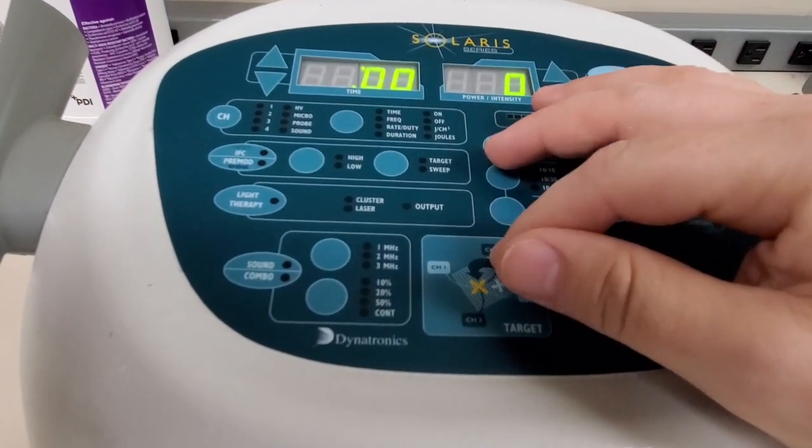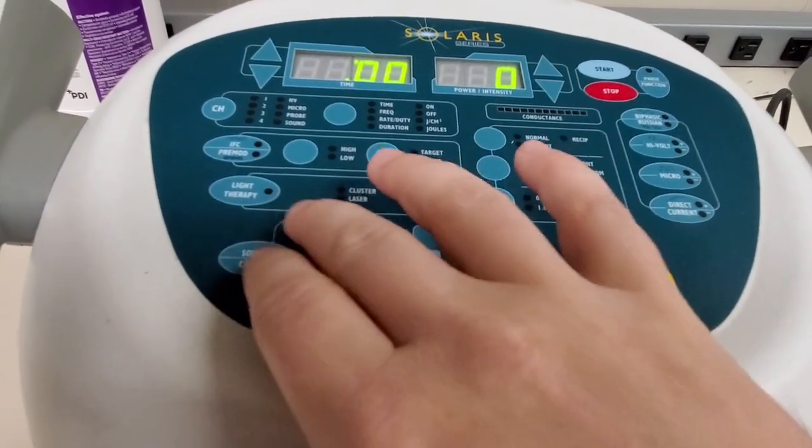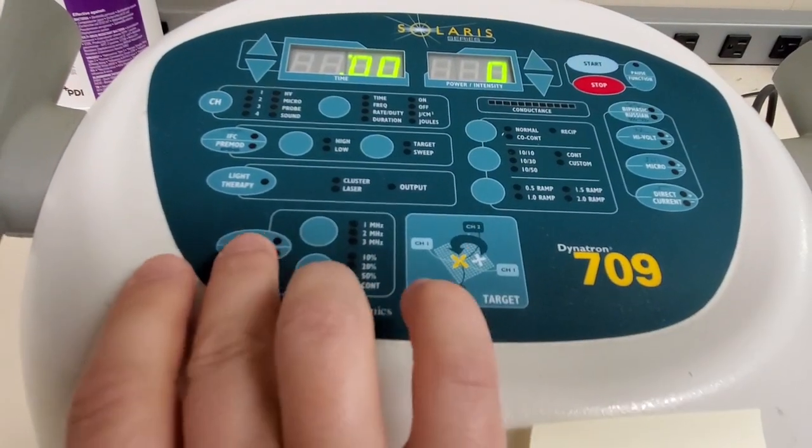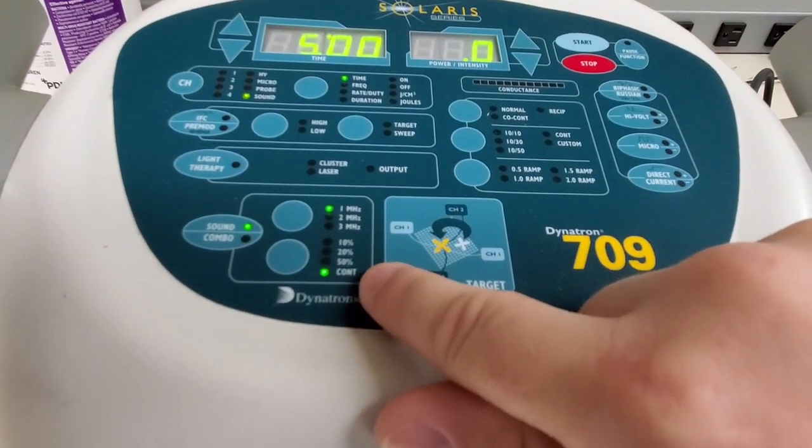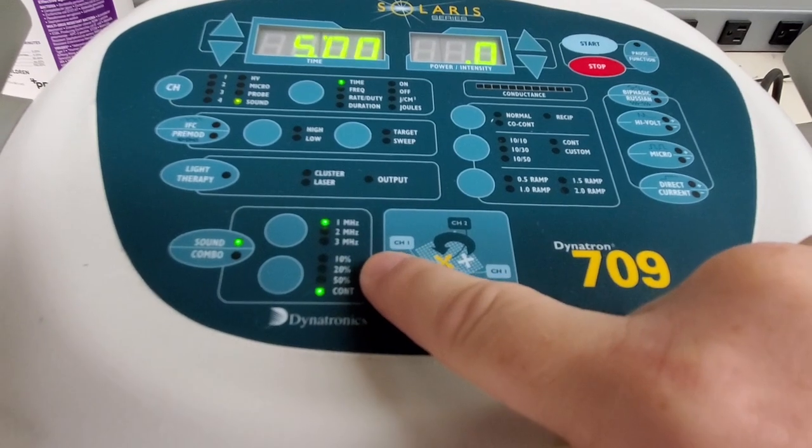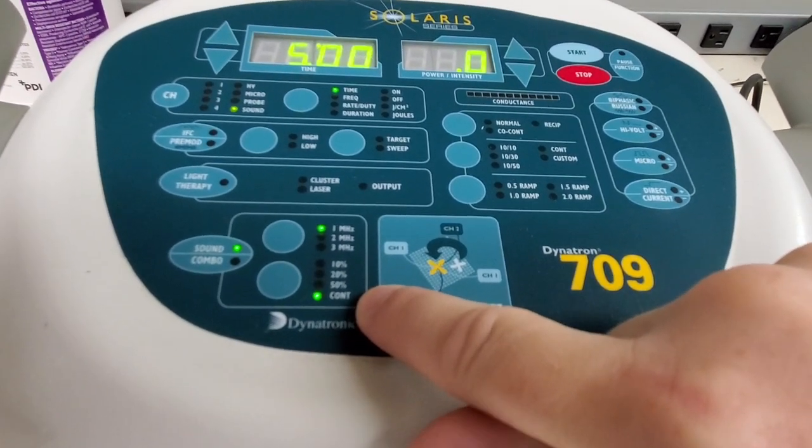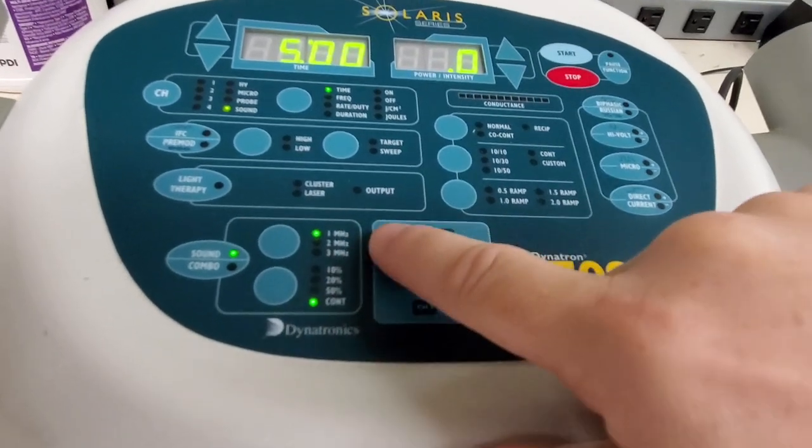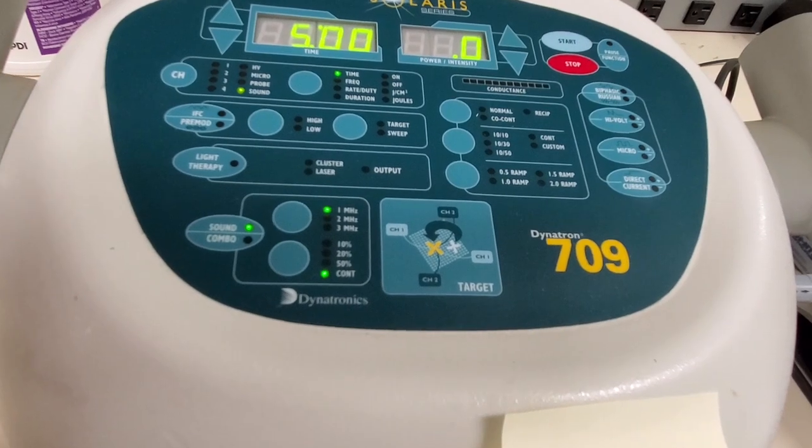Despite all these buttons up here on this particular unit, it's got various other functions like stem capabilities for muscle stimulation and a few other things. But all that we're concerned about is this area down here for ultrasound. Now you can see this is duty cycle - 10%, 20%, 50%, and continuous duty which means it's always on. And then you can see up here it says 1 megahertz, 2 megahertz, and 3 megahertz.